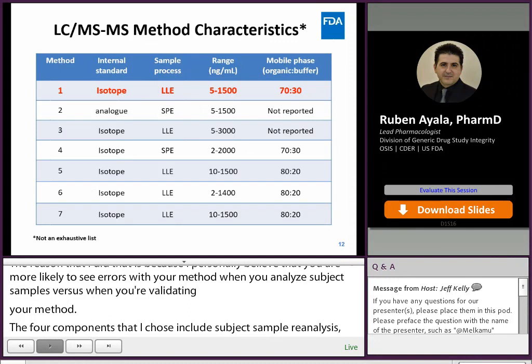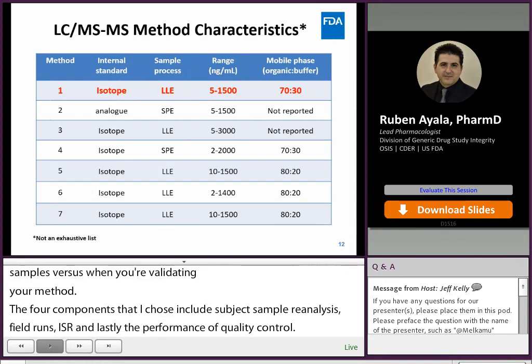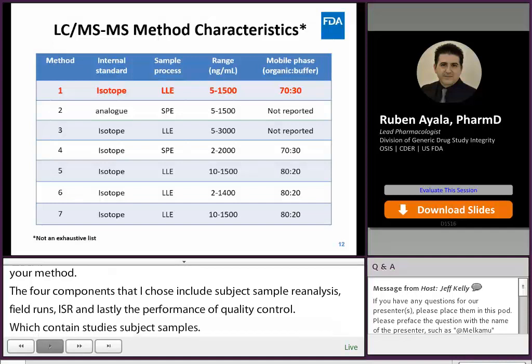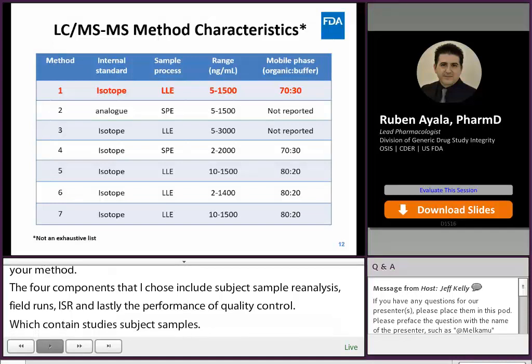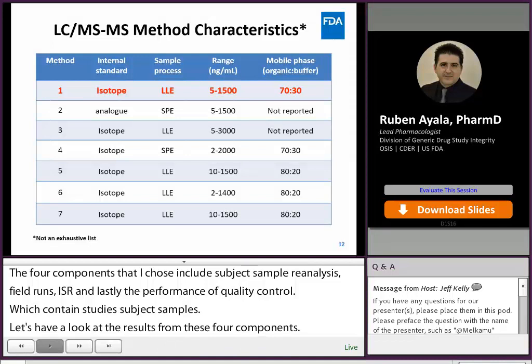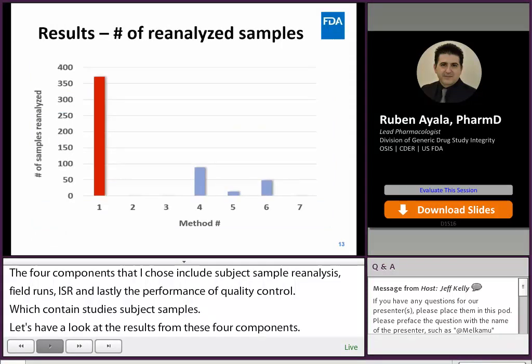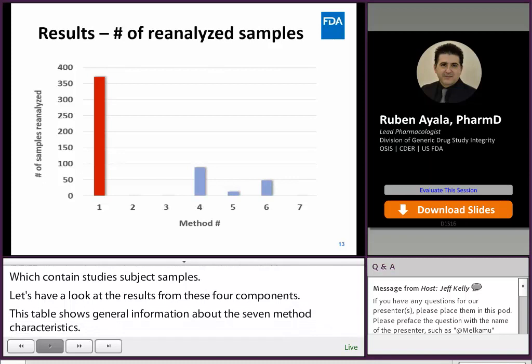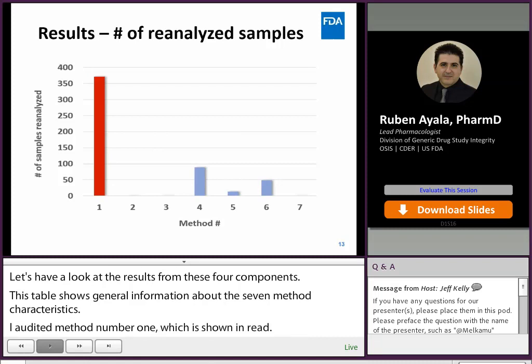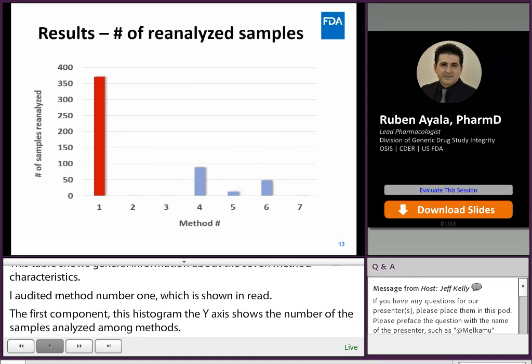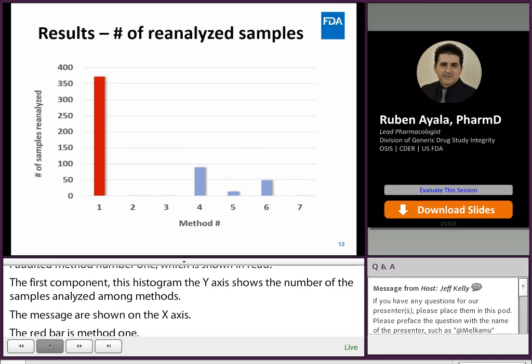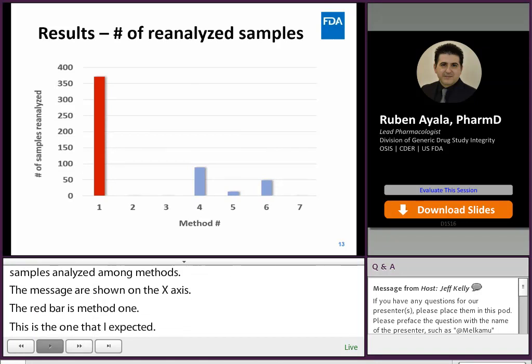This table shows general information about the seven LC-MS/MS method characteristics. I audited method number one, shown in red. The first component evaluated was study sample reanalysis. In this histogram, the y-axis shows the number of samples reanalyzed among methods, and the methods are shown on the x-axis. The red bar is method one — the method I inspected — and the blue bars are the other methods compared. Method one had the highest number of reanalyzed samples among all the methods, as high as 15% of all study samples received by the company.